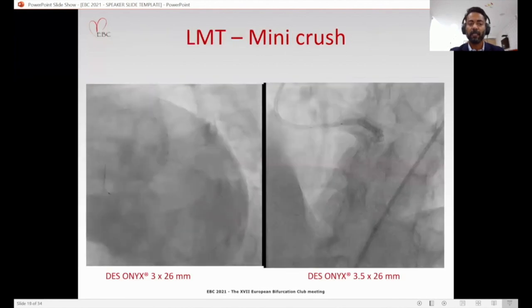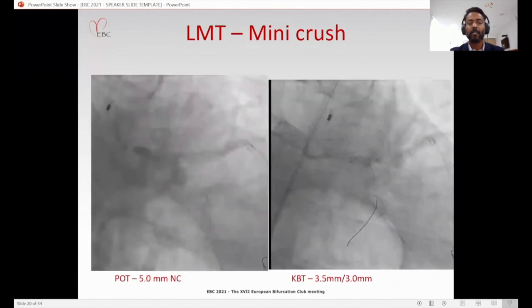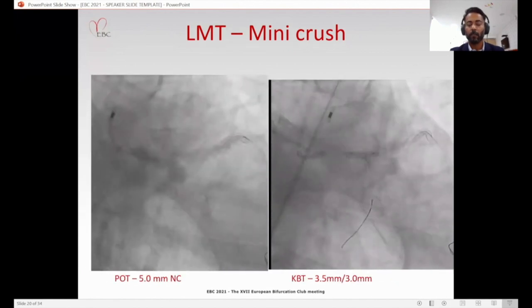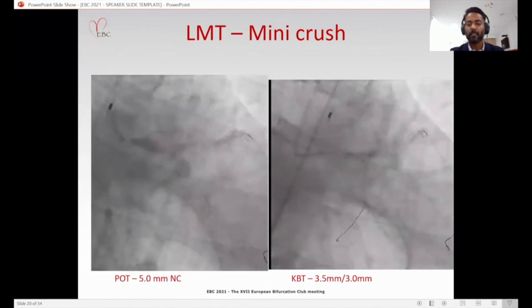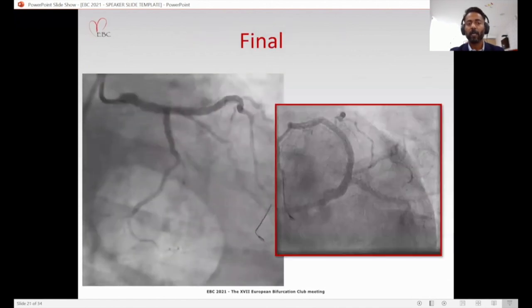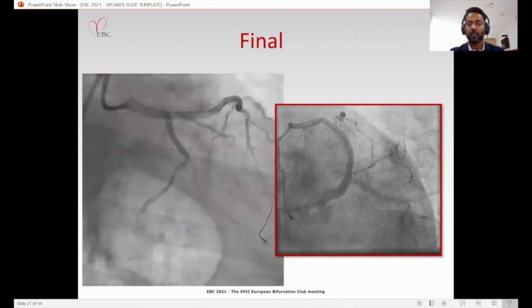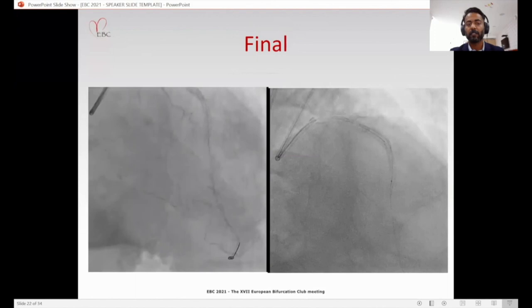We immediately stented the left main bifurcation with a mini crush strategy and stented the circumflex with a 3x26 and left main to LAD with a 3.5x26 millimeter DES. We did a POT in the left main with a 5 millimeter balloon. And then we did a final kissing balloon with 3.5 and 3 millimeter NC balloons in the LAD and circumflex respectively. We got a good angiographic result, as we can see in this caudal projection. And we got a good angiographic result in the cranial projection with no occlusion of the diagonal.